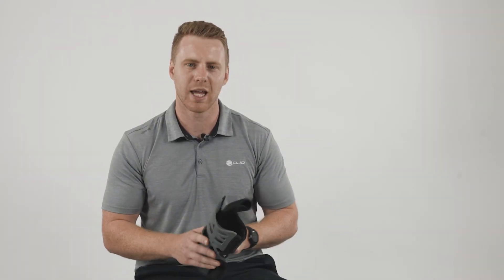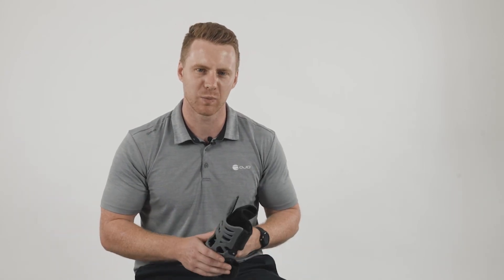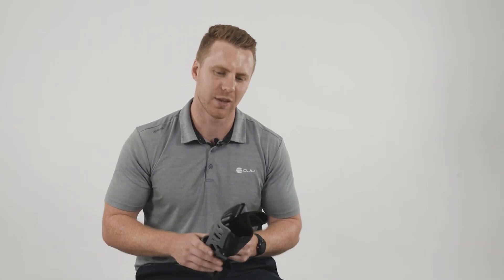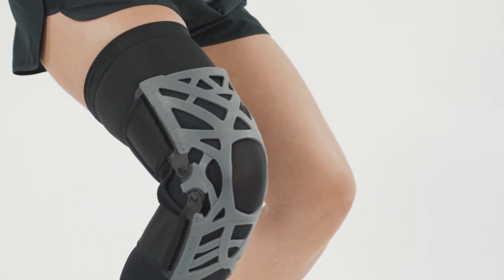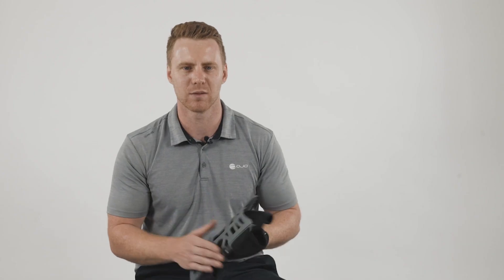Like most of our knee braces, we have quite a lot of research data to support the clinical efficacy. Feel free to get in touch and we'll be more than happy to share those research articles with you. The Reaction Knee Brace in particular has already been used by a number of our clinicians, often as an adjunct to rehabilitation programs to help their patients return to their previous level of activity. Thank you.